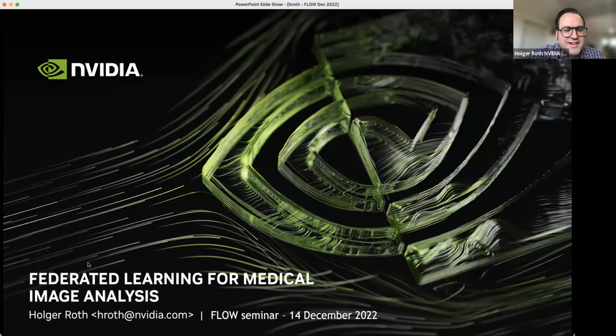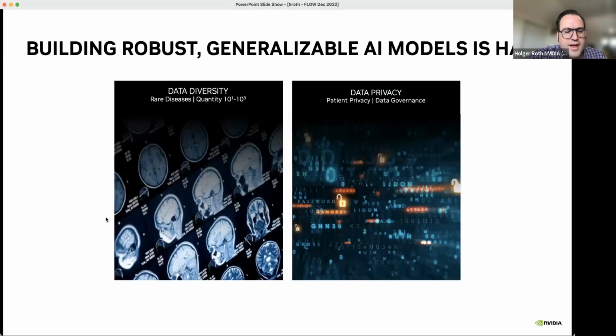Hey, thank you very much for the kind introduction. As the title indicates, I'm focusing mainly on the use case of federated learning for medical image analysis. In healthcare applications in general, we want to build very robust and generalizable models so that they can be applied in clinical practice in the hospitals, for clinical workflows. It's well known that for that, you need training data sets that are diverse and capture really your patient population as the algorithm would see in practice when being deployed in the hospital. So it's important to build up large, diverse data sets spanning different patient populations, different diseases, different scanner types, and acquisition protocols, in order to make these algorithms more robust.